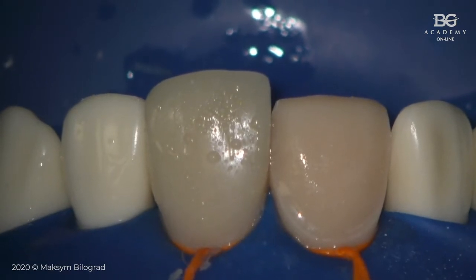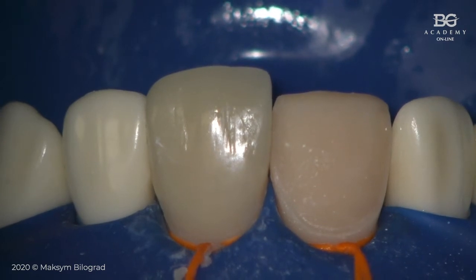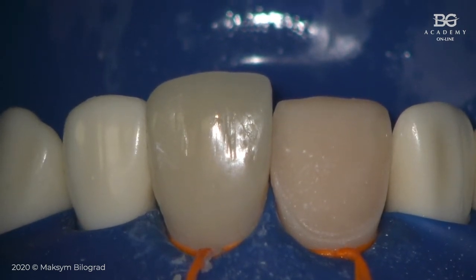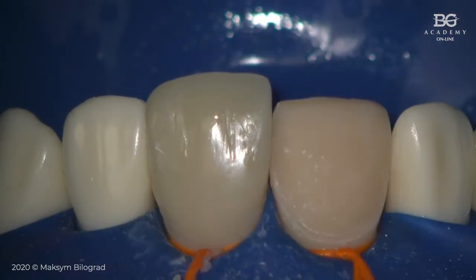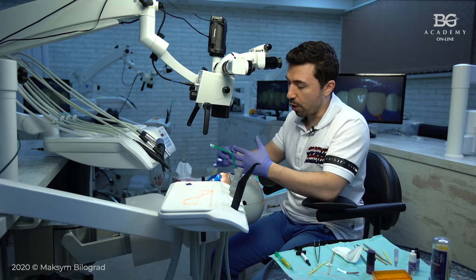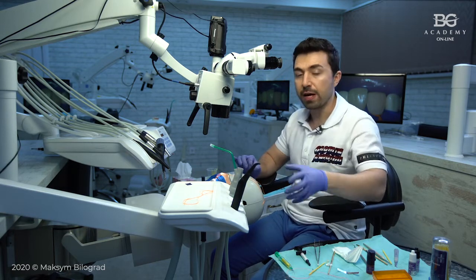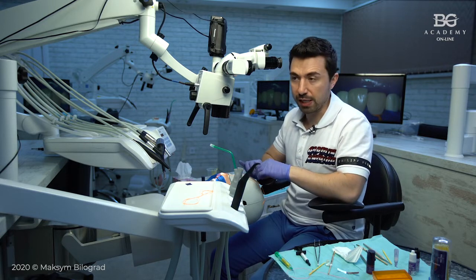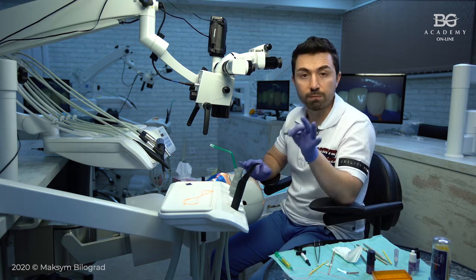Okay, now we are ready for another central incisor. In clinic, all this process takes not that much time like here, because I'm doing a lot of explanation, showing you some tips, tricks, I'm working with an assistant, but it has to be relatively fast. But now I have to cement another one, and the thing is, if at the very beginning of my process of bonding I understand that I will bond one central incisor and then I will bond another central incisor, I will sandblast only one central incisor that I will bond my veneer to.